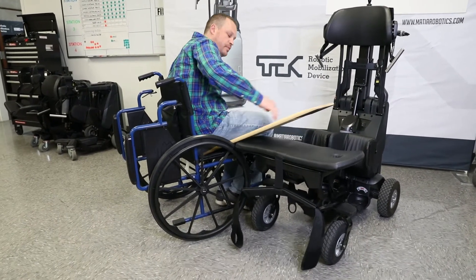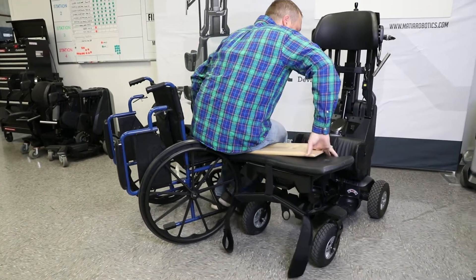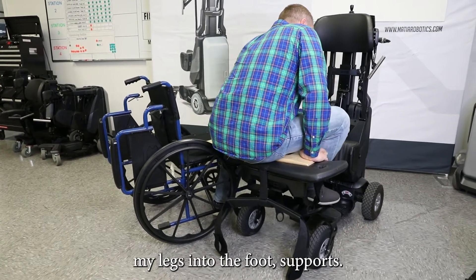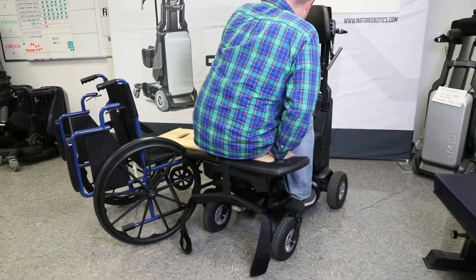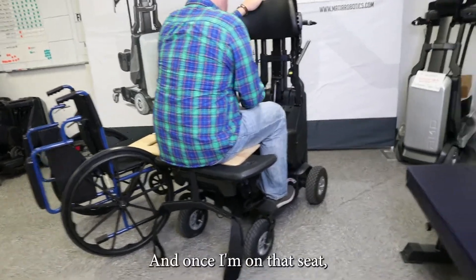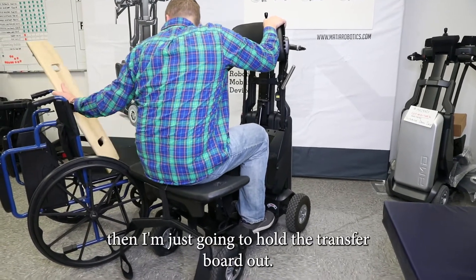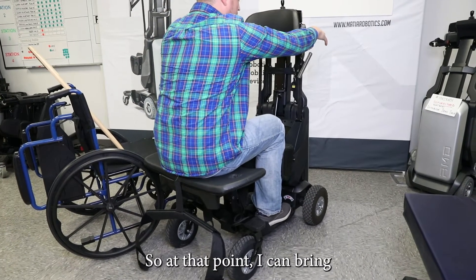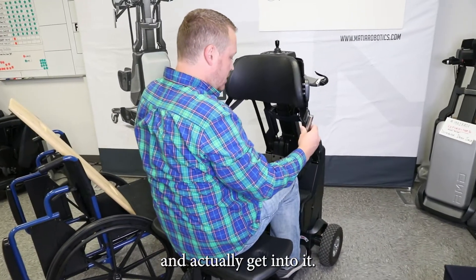I'll use the transfer board to show. Essentially what I'm going to do is just get in and slide myself over, bring my legs into the foot supports. I can use the device up here to hold on if I need to. Once I'm on that seat, I'm just going to pull the transfer board out. With the cushion underneath me, I can bring the device back to me and actually get into it.